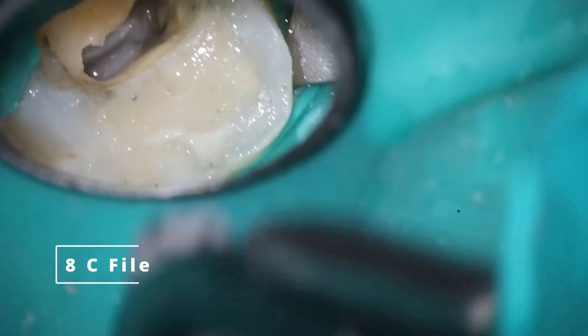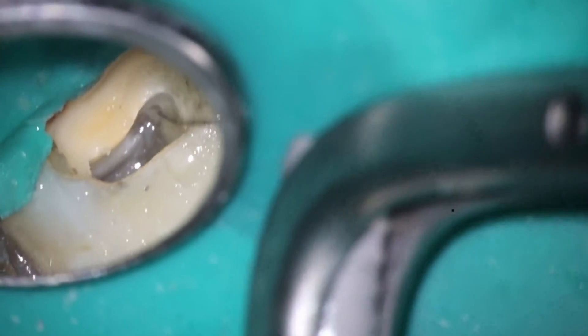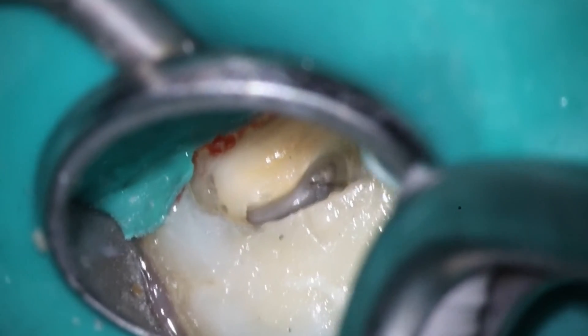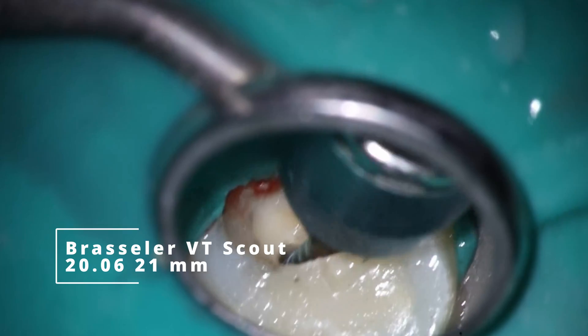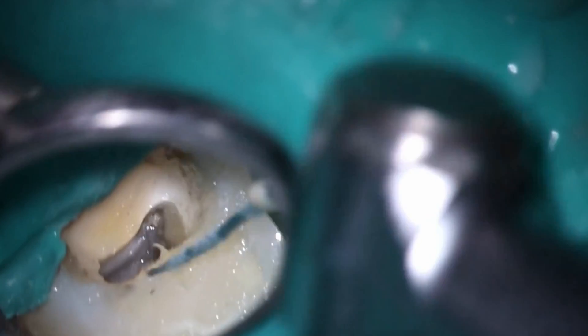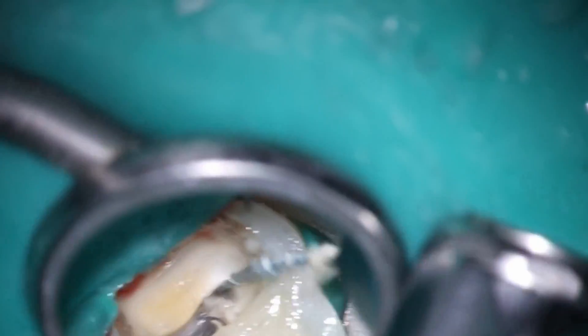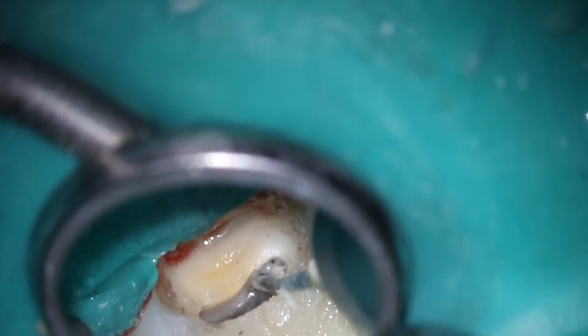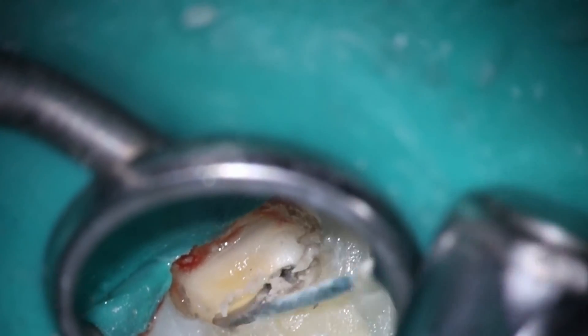I'm already starting to do a little bit of troughing along where I believe the MB2 would be based off of what we normally see. Go ahead and take the 8C file down. The other three canals are very straightforward when it comes to this tooth — a little bit of hesitation on the MB1, but nothing we won't be able to get through. I'm trying to get into where I believe the MB2 would be. Go ahead and open it up with the 2006, just like we do normally for that coronal flare. The palatal and the distal buccal are super straightforward, even MB1 is pretty straightforward here.